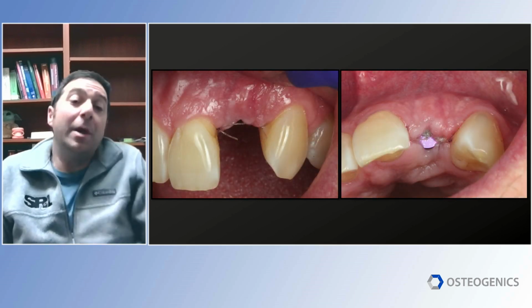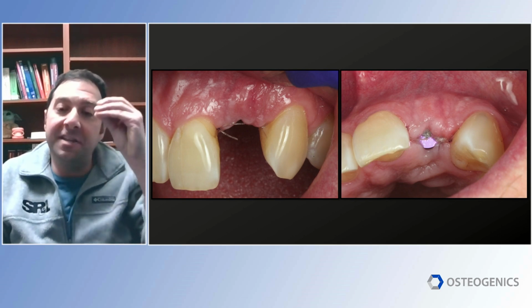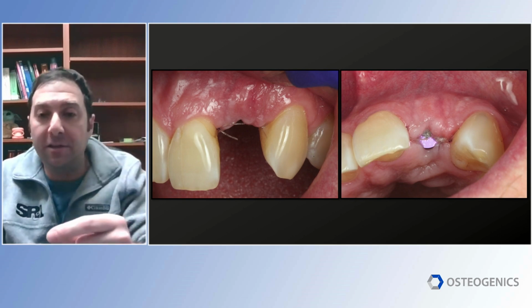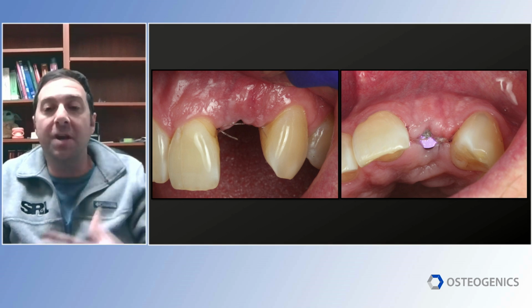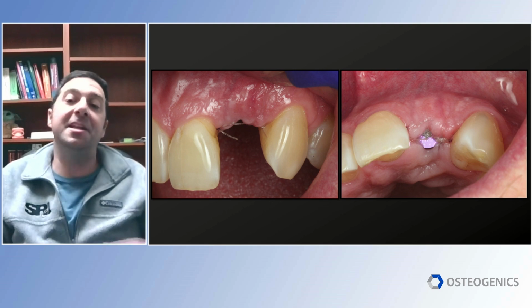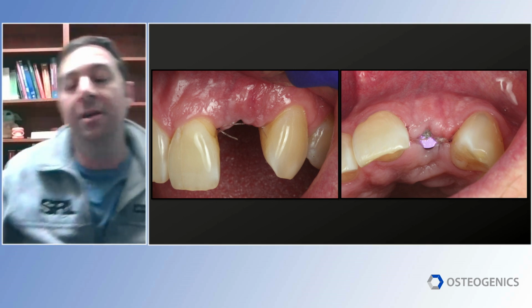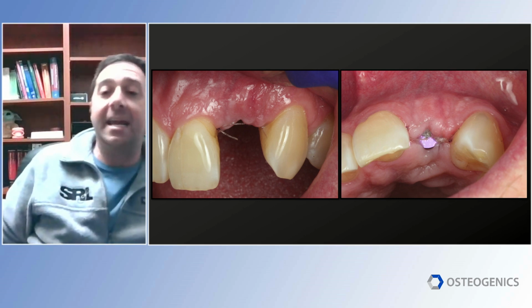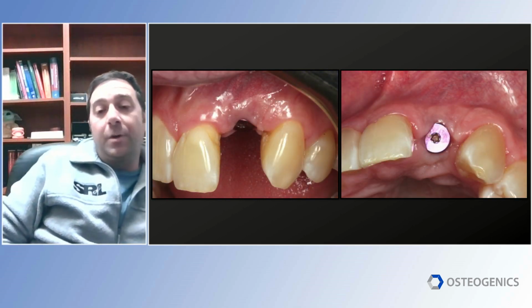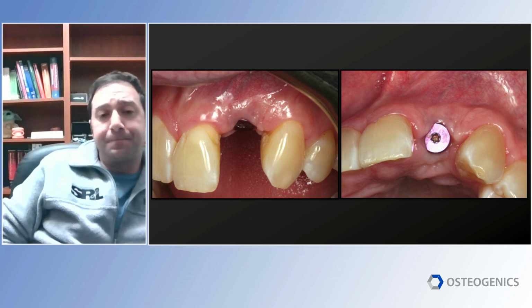And again, 2 weeks. So 2 weeks, the soft tissue looks great, very little inflammation, no signs of necrosis. The patient came back and said they had a nice result. And then you could see on the buccal from the occlusal shot how much dimension we were able to gain. Here we are about 3 months out, ready for restoration.